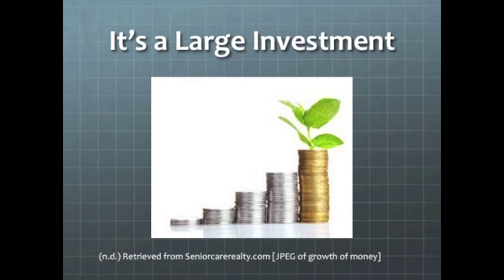Some of the factors that should be considered prior to purchasing a PACS solution include financial resources and IT infrastructure, including the capabilities of your organization's IT department, implementation work plan, and contractual terms, including warranty, maintenance and support, interoperability, and data security.